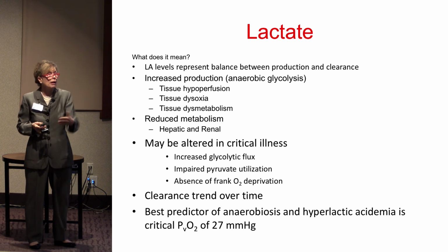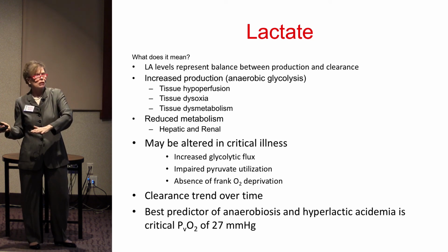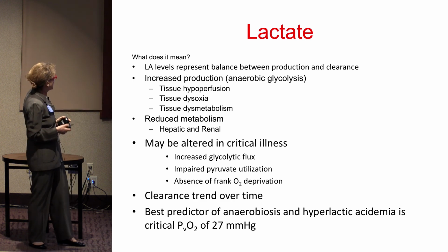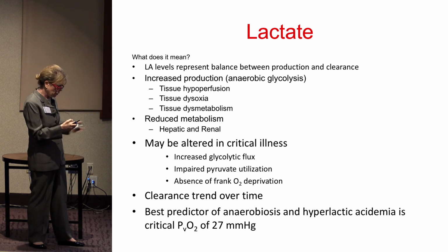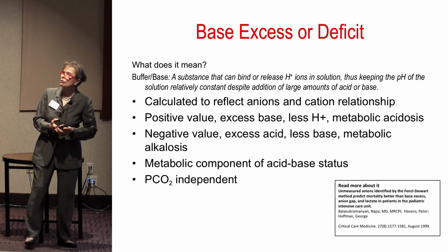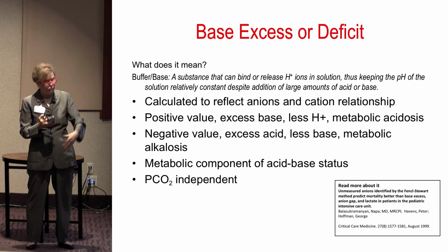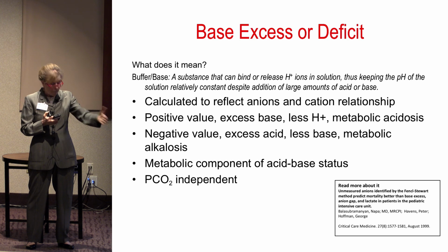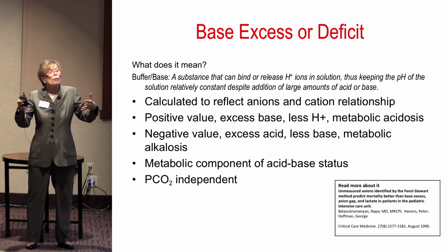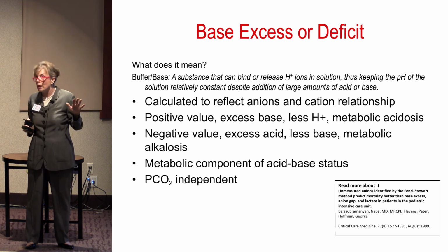It goes up when you have diabetic ketoacidosis, and it becomes hard to differentiate what's hypovolemic and what's because of dysmetabolism. So we just want to be intelligent about evaluating this and want to just always remind ourselves that we're going to look at this in conjunction with my favorite, which would be the base excess or deficit. So I just want to remind everybody, I don't want to say anything too simply, but you can see I'm talking fast, that the base is a more pure, even though it's calculated, a more pure indicator of total buffering capability for the production of metabolic acid.